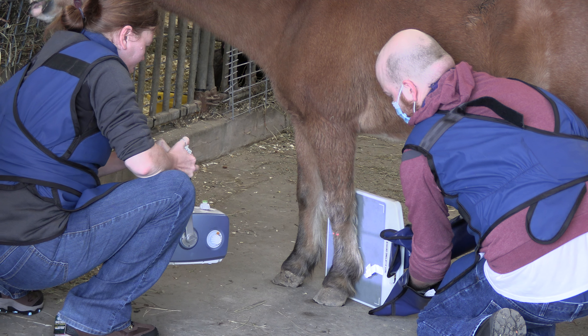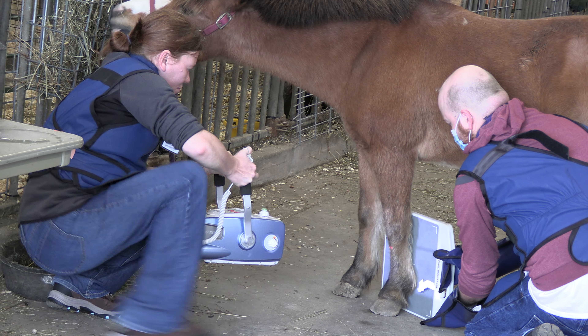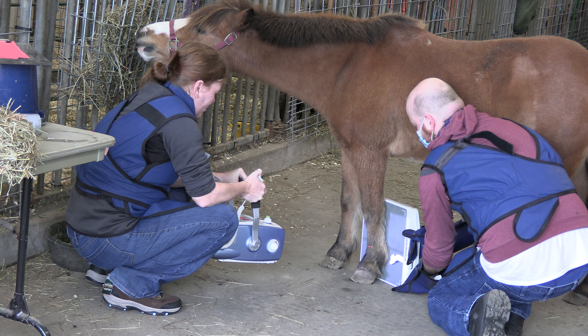Make sure you have like a 45 degree angle. And I think you're a little close. Bring those two dots to the plate — put those two red dots on the plate.